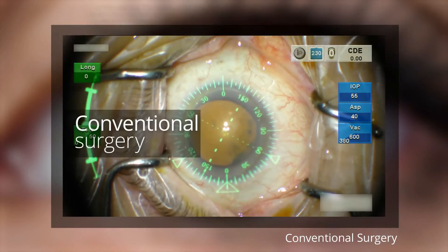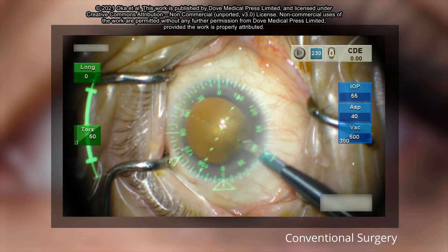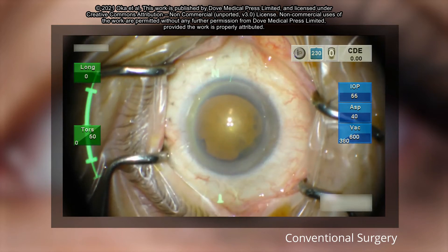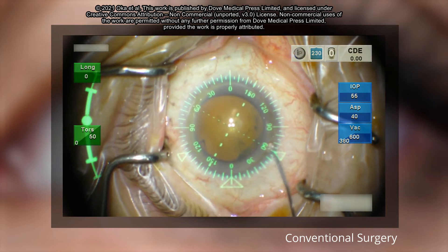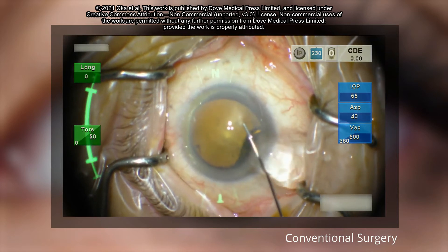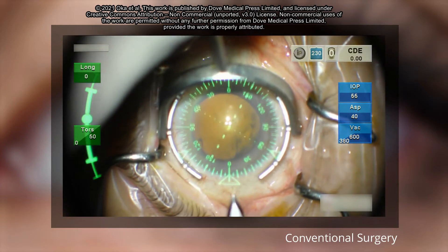The eye is being stabilized to maintain the correct biomechanical orientation. Here you can see the surgeon performing paracentesis at 60 degrees and 120 degrees. An image-guided system is used to help guide precise incision placement in the predetermined axis. OVD is then inserted, and the main incision is made at 0 degrees.